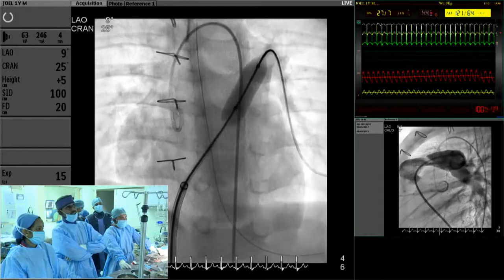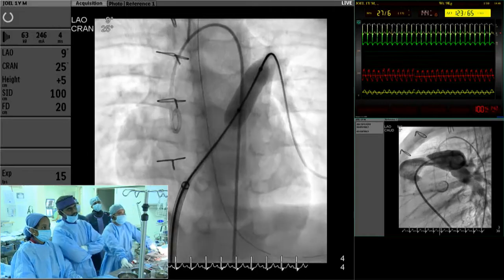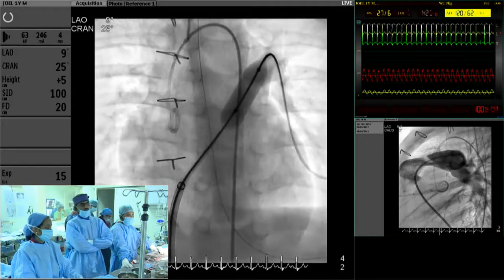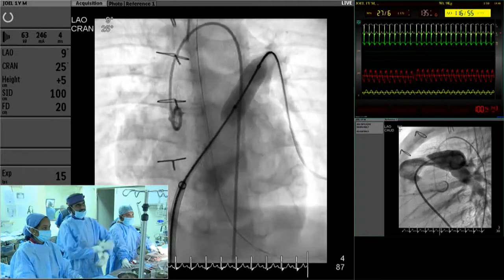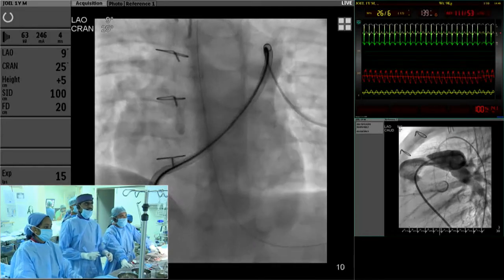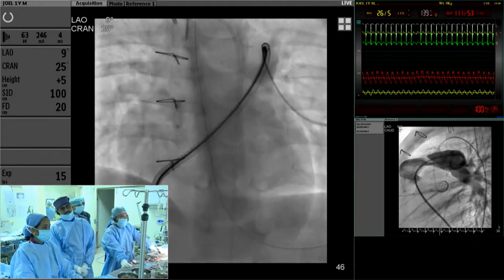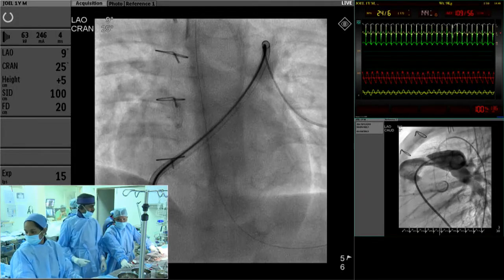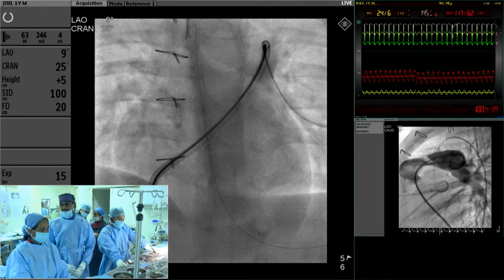Yeah, balloon interrogation. This is the Cook Formula stent's 10 millimeter balloon, because we wanted a balloon which will widen out completely to the full 10 millimeter, rather than a Tyshak 2 balloon which might be partially constrained. Next picture. After this we advanced the sheath inside. Our intention is to stent the conduit using a 10 mm or maybe a 12 mm Formula stent. It's a 1.5-year-old child weighing 9 kilograms.